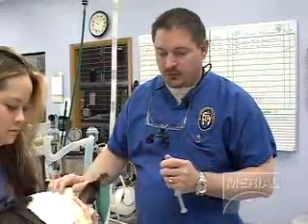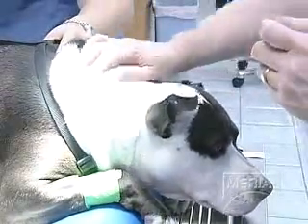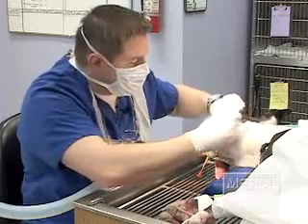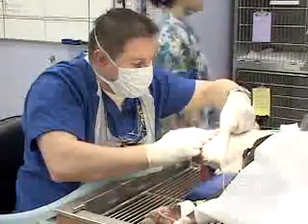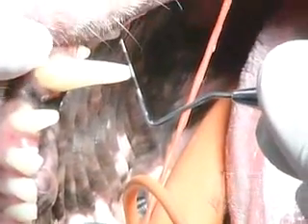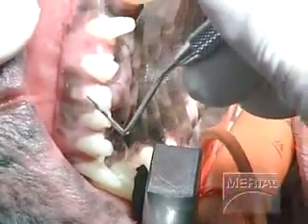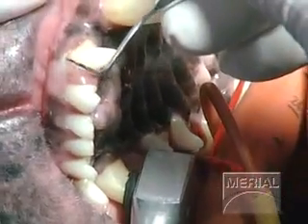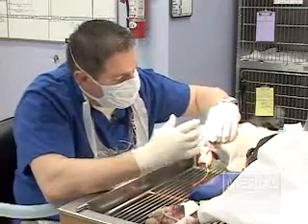Wauquita has been premedicated with a medication to relax her, and another medication to dry up the saliva so she's not drooling as much. The second of the 12 steps of the professional dental cleaning is the examination under general anesthesia. I'll be probing using a periodontal probe. This probe has measurements — the first black mark is 3 millimeters, then 6, 9, and 12. I'll be placing this into the sulcus and probing gently, seeing if there are any pockets. Overall, I don't see anything major except the early stages of periodontal disease.